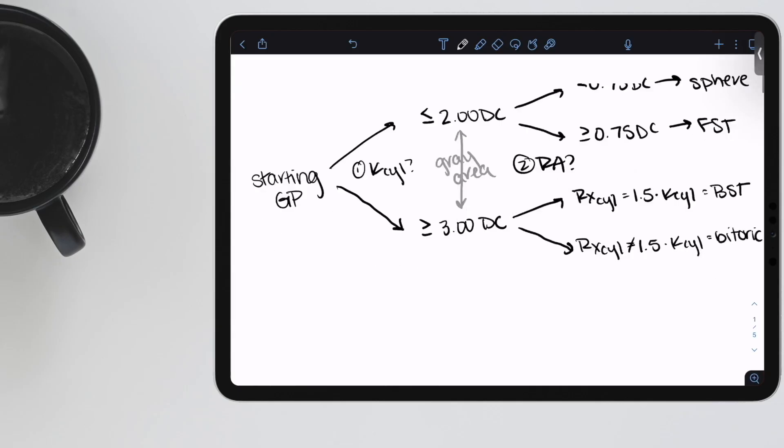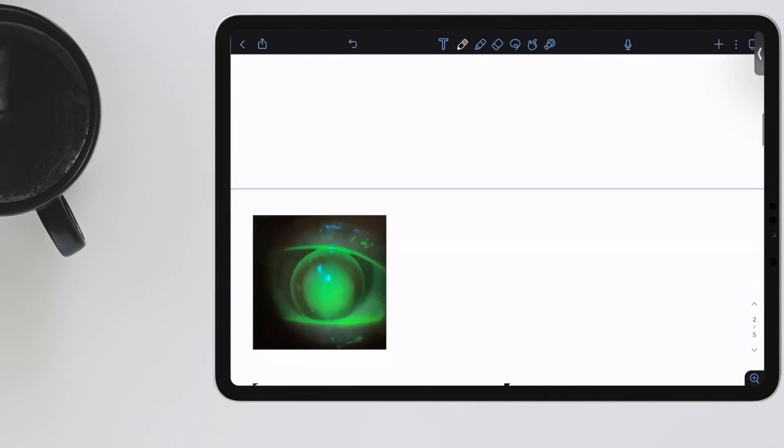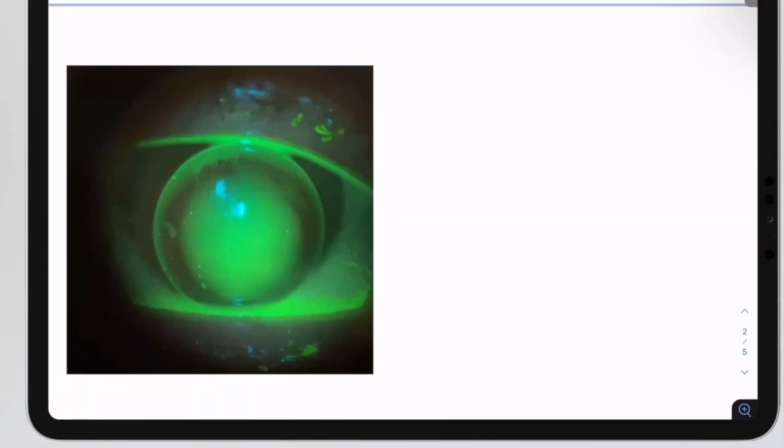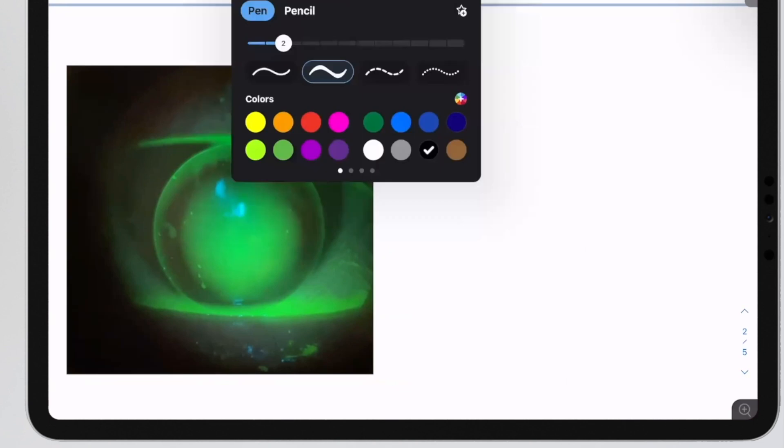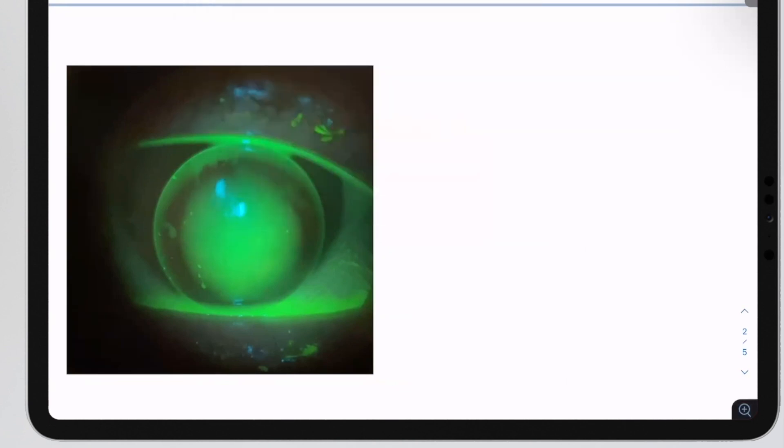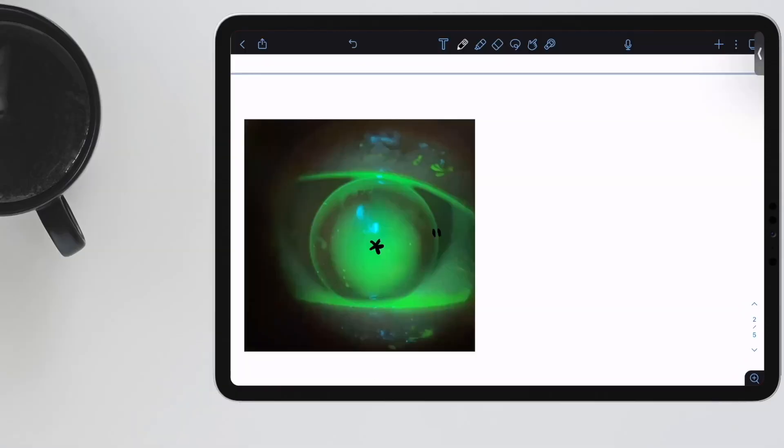You've picked out your lens, you put it on the eye. This is a really steep fitting lens. Why? Because you have all of this fluorescein pooling here in the center. You can't see the iris details through that fluorescein. You also see really thin peripheral curves in some areas and then an area of mid-peripheral bearing in the lens as well.